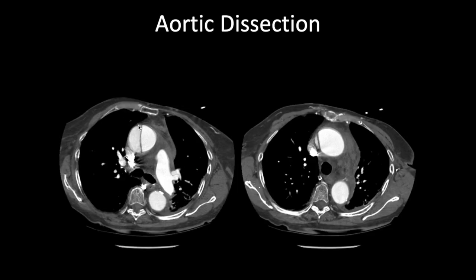This is a case of aortic dissection. This is your ascending aorta and descending aorta, with the sternum and vertebral body for orientation. Within the ascending aorta, you can see this flap — this is an intimal flap in this patient with an aortic dissection. The dissection only involves the ascending aorta and does not involve the descending aorta. This is a Stanford type A aortic dissection.